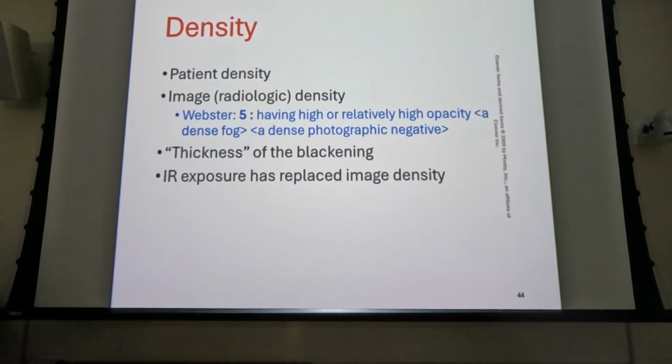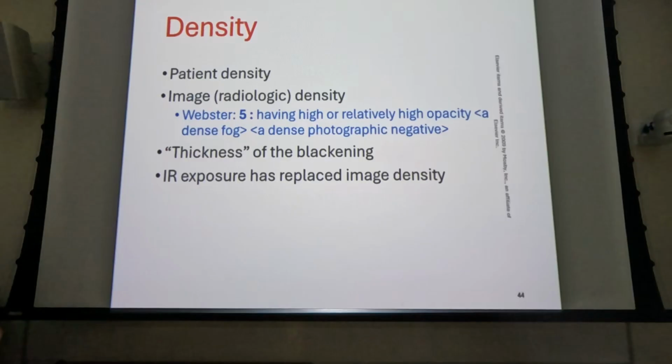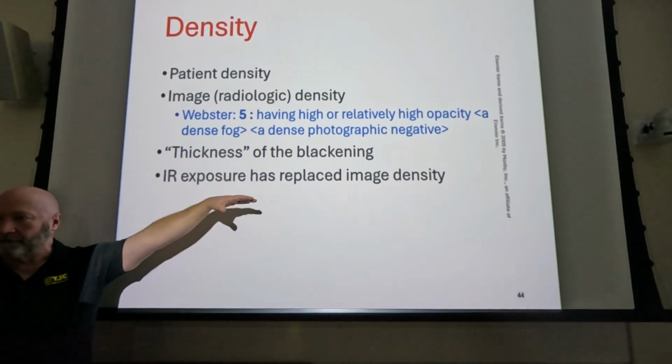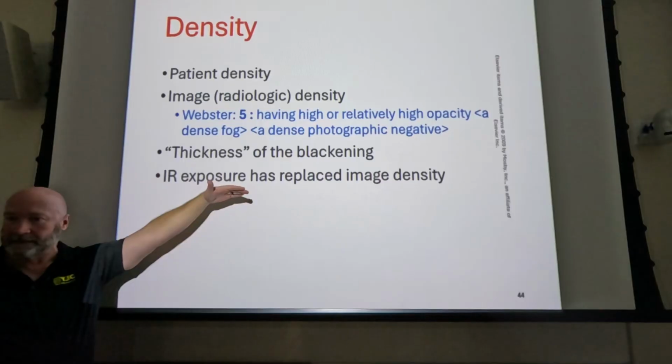It thinks you've got a very subtractive pathology that is too easy to penetrate, and it's going to adjust your overall density and your contrast. It's potentially going to come out a bad image. So the area that got the direct exposure is going to be very dark. That's very high density.